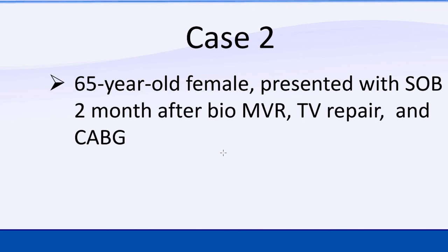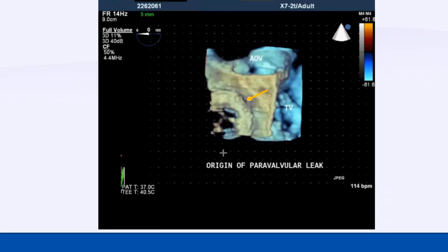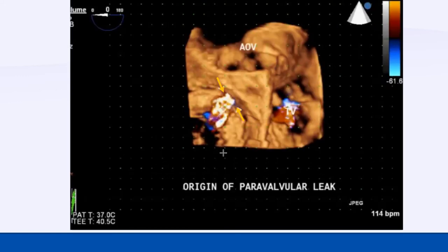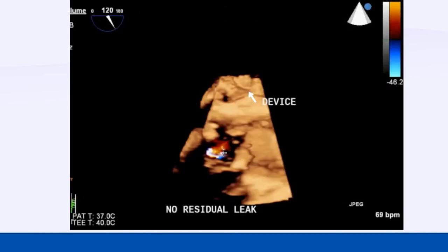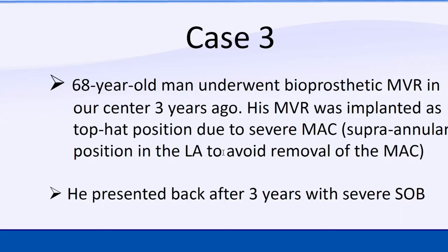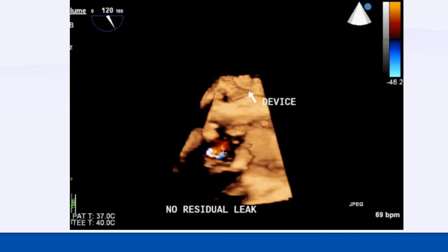Now let me show a couple of cases. This case had a previous bioprosthetic mitral valve replacement in our center in Saudi Arabia, and you see a leak here. In 3D you can see a small dehiscence of the valve beside the aorta. We gave this address to our interventionist, who went from the aorta — since the leak was just beside it — through the aorta to the left-sided structure and placed a device, like a PDA device, and closed it. It is very important to give the right address.